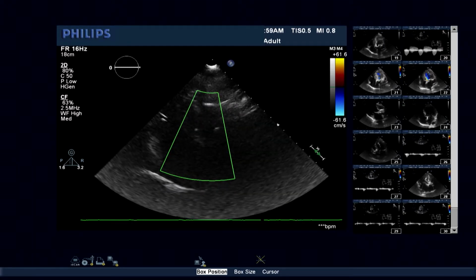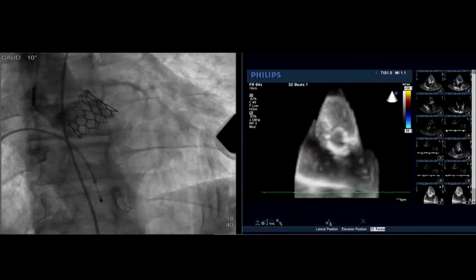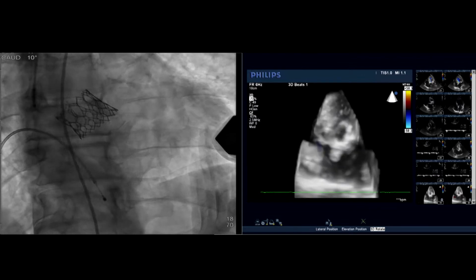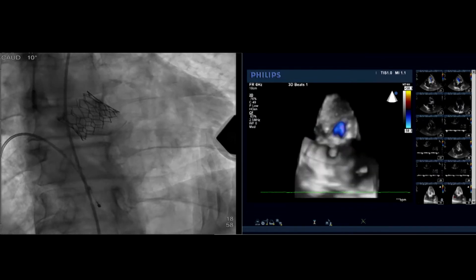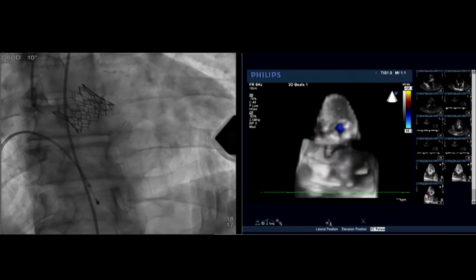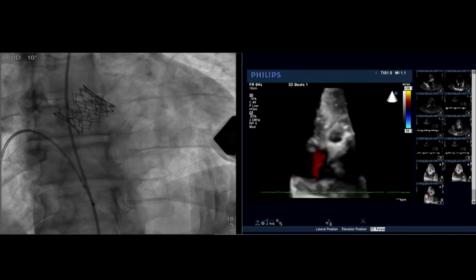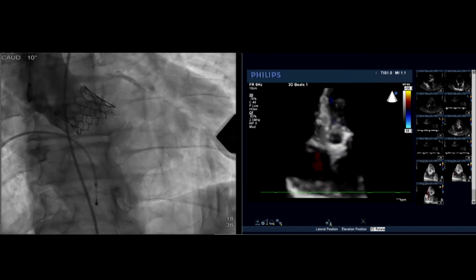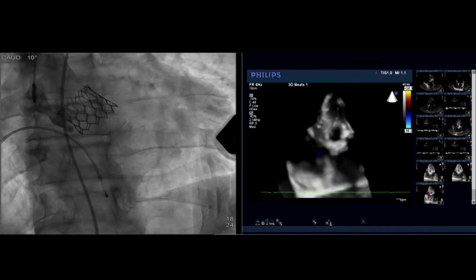So let us do one thing. Let us come out with the catheter. Let us put our pigtail down, do some hemodynamic measurement. The reason is we have good gradient. There's almost no gradients on echo, and the valve is well in place. There's nothing in the coronary arteries. Both of them are flowing. So I think if everybody agrees, we need not cross the valve again.